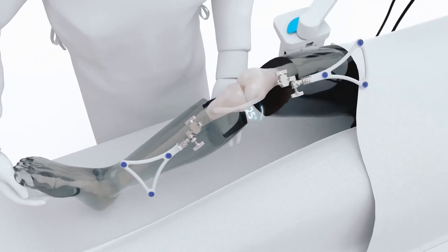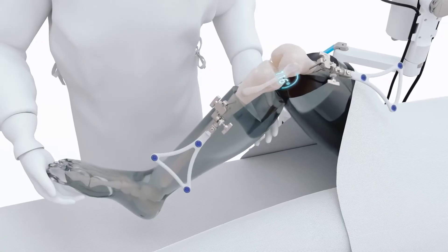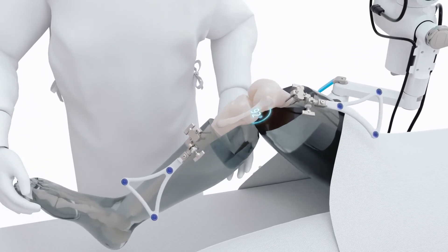Your surgeon will move your leg back and forth to test the function of your knee. This will help assess your full leg alignment and soft tissue tension.